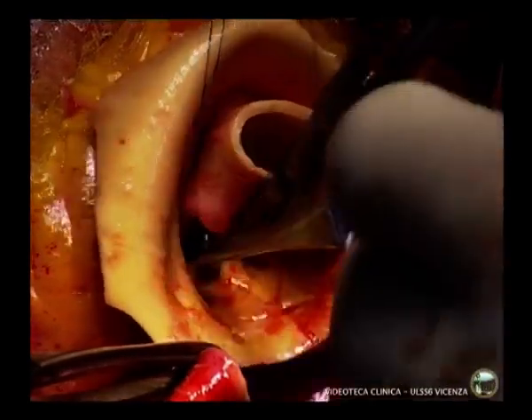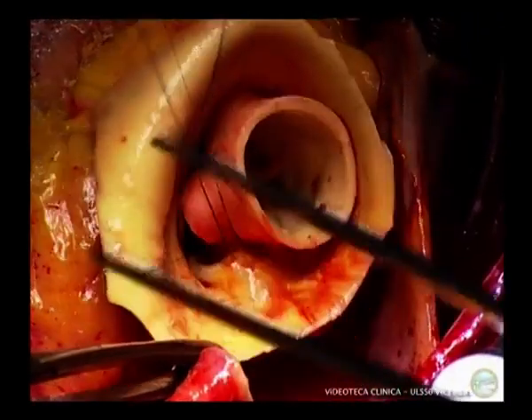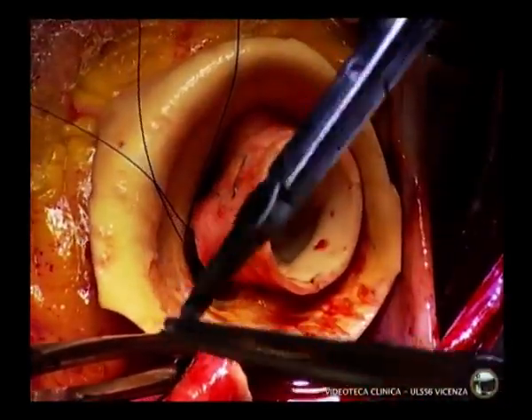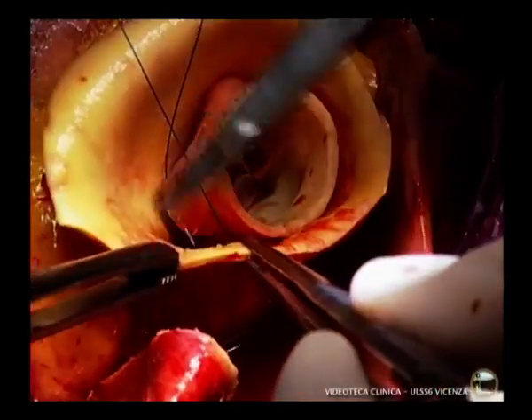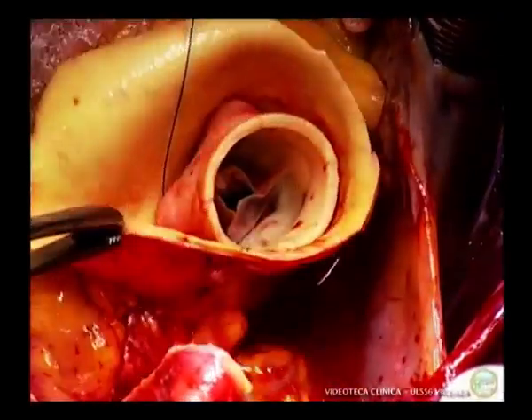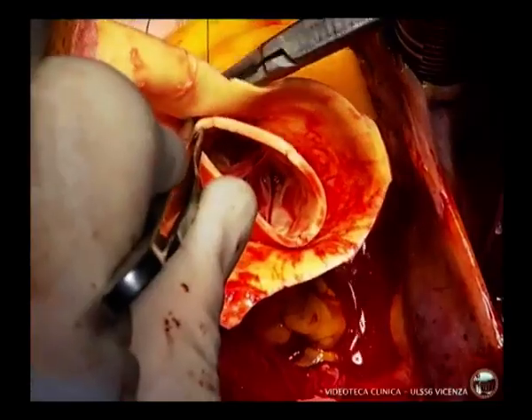Re-implantation of the coronary ostia, first the left, and then the right.